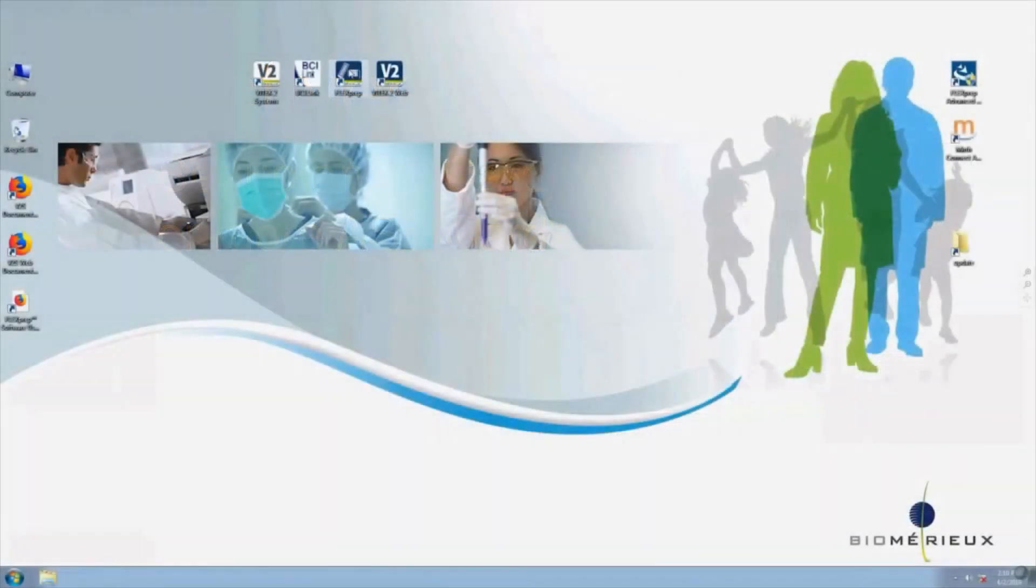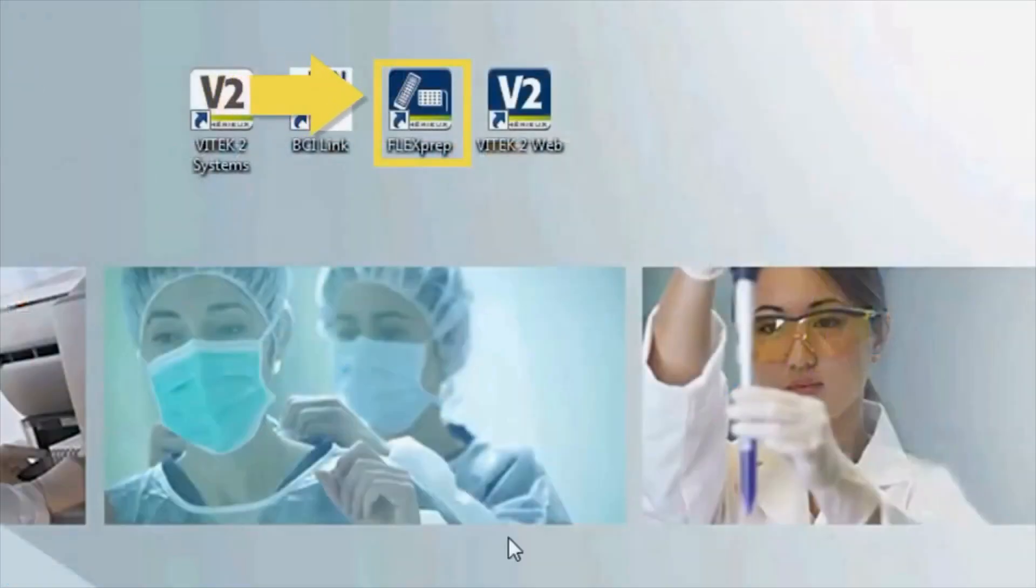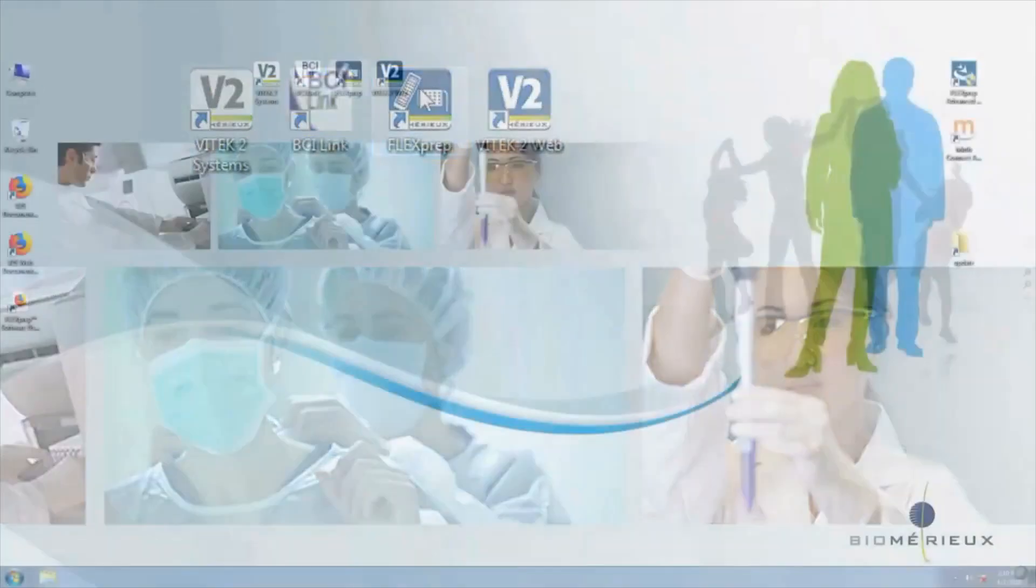To open Vitek FlexPrep, double-click the FlexPrep icon located on the computer desktop and log in.